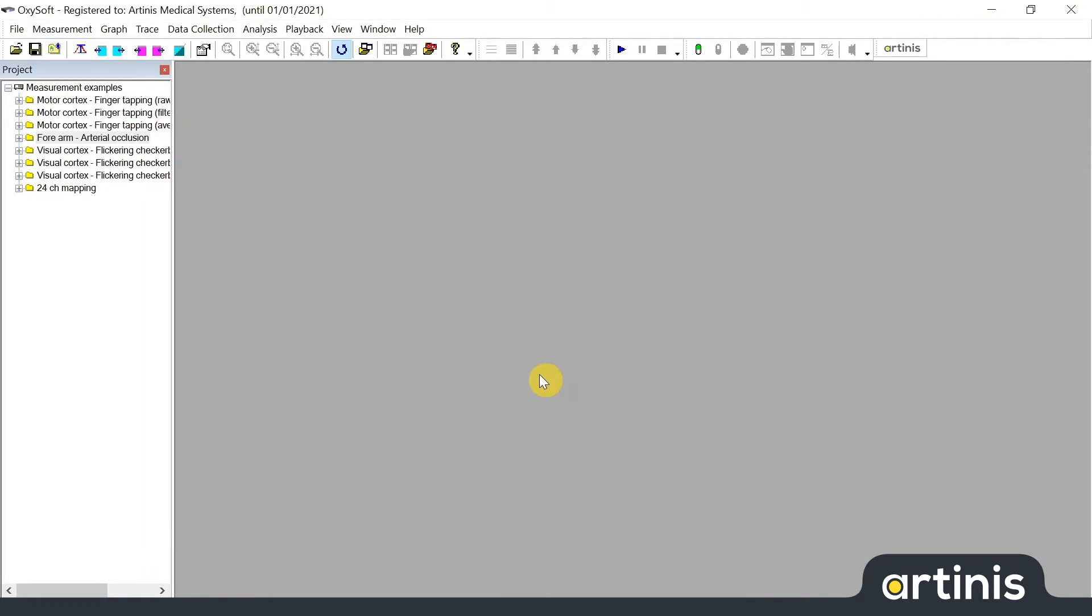Hi, my name is Czeri from Artinis Medical Systems. In this video I will show you how to export your data from OxySoft to other formats.